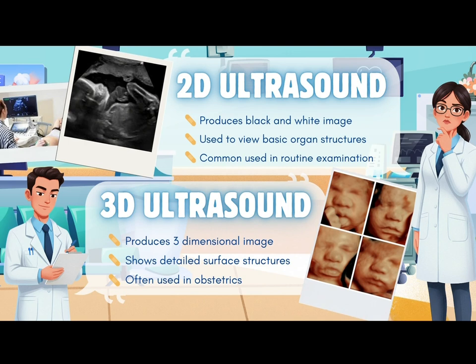It produces black and white images that allow doctors to view the basic structures of organs. It is usually performed as the first examination because it gives a general overview of the patient's condition. If any abnormality is suspected, doctors may proceed with more advanced ultrasound techniques.